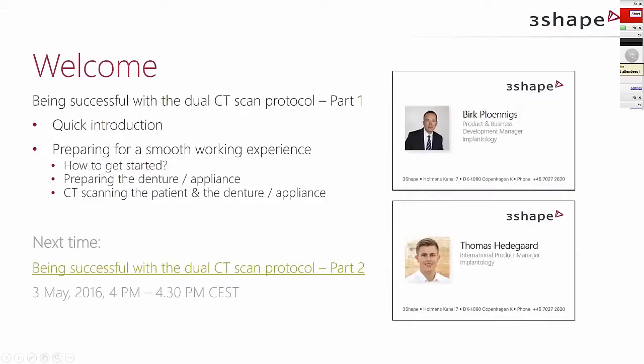Yeah, let's look at it. So, Birk quickly mentioned this new webinar series that we're running where we really want to share some tips and tricks from users to users. That's the whole idea of this live series. We want to distribute knowledge, both what we have internally and what we're working on and why we develop the things we do, but also the feedback we get from users all over the world. Today we're going to look very much at the practical side of being successful with the dual CT scan protocol.